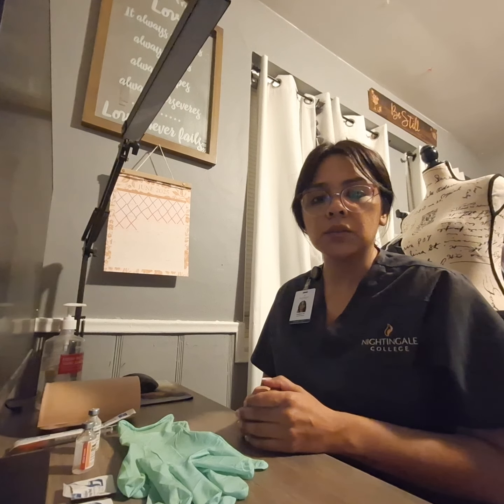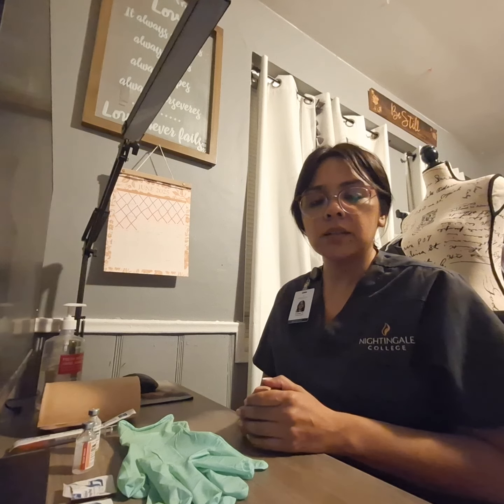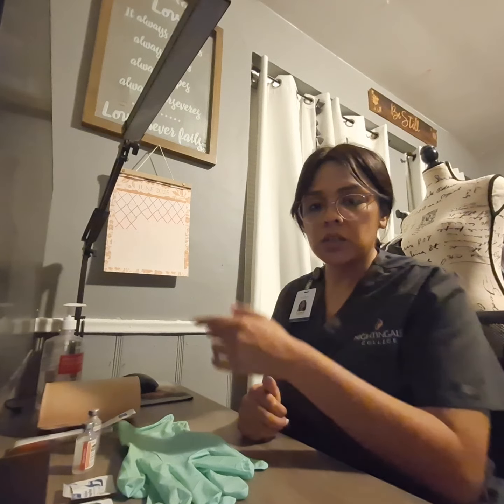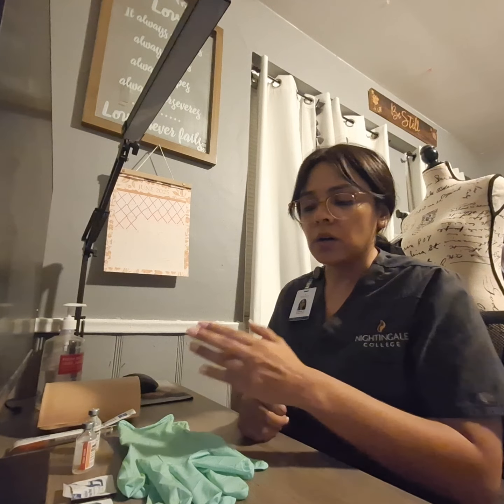I'll verify the 6 rights of medication administration, making sure I have the right patient, drug, dose, route, time, and the right documentation. I will pull up the patient's information in the EHR. I'll verify the order. I'll verify the medications that I pulled match the order. I have gathered all of the supplies.